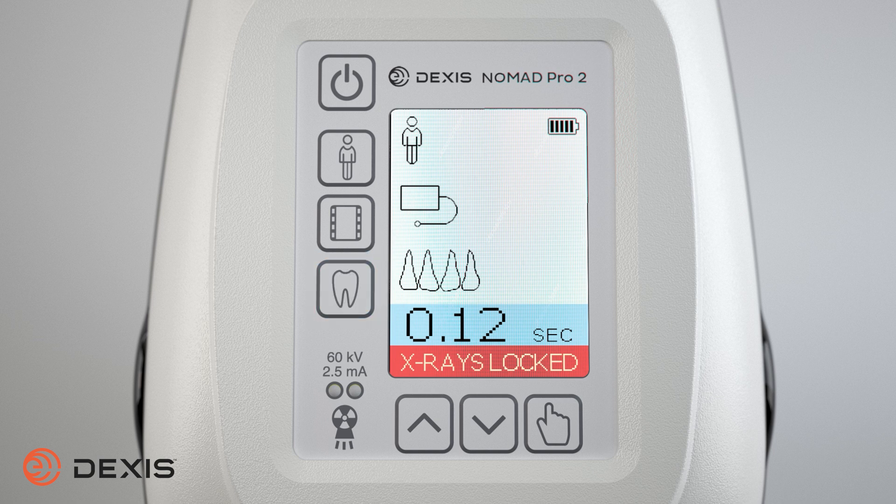By pressing the tooth group button, you can select the image representing either the anterior periapical, posterior periapical, or bite-wing radiographs. Once again, the time setting adjusts accordingly. In addition, the increase or decrease buttons may be used to further adjust the exposure time.